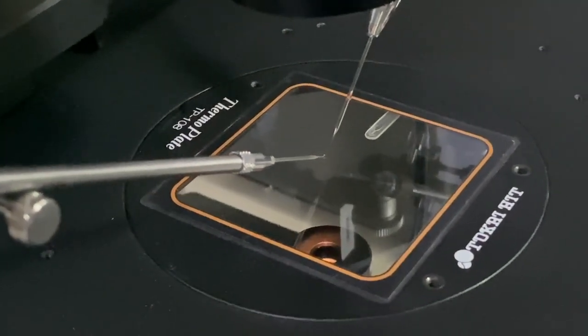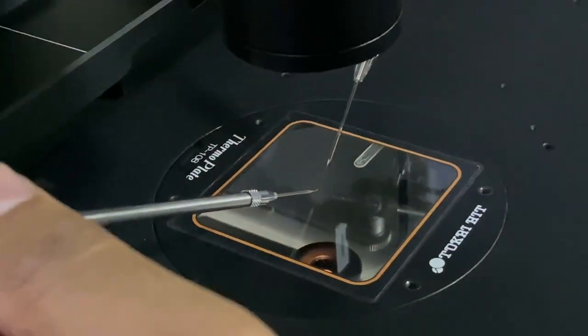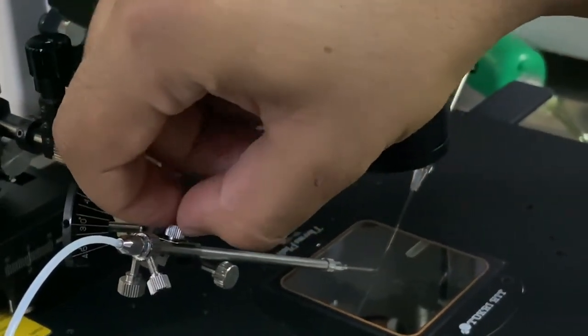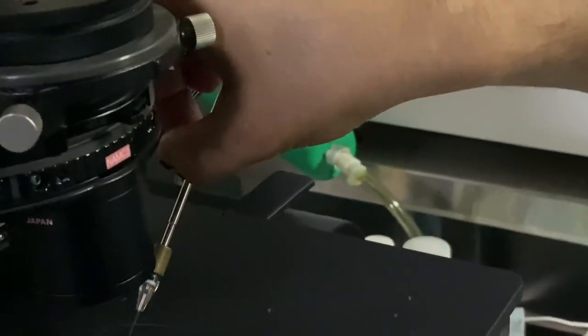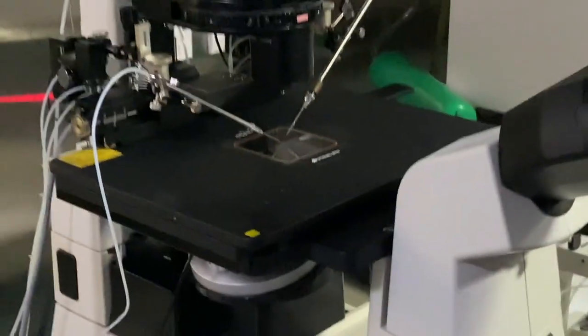Now it is almost very close. Although I cannot show you because it is inside a microscope, you can see clearly on the display that both the holding needle from the left side and the injector from the right side are aligned. Once they are aligned, we have a knob here to tighten it. I will tighten this knob so that they don't move during the procedure. Similarly, I will do the same with the injecting needle. Once it is done, they are fixed. That means our ICSI micromanipulator is aligned. Now we are ready to do our ICSI.